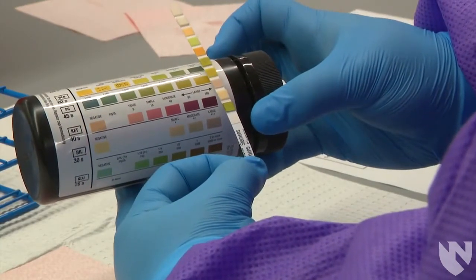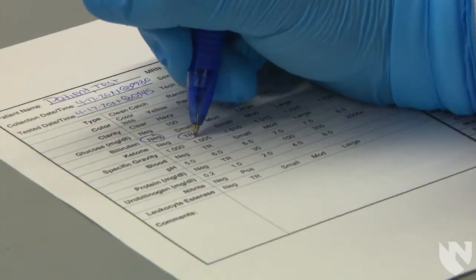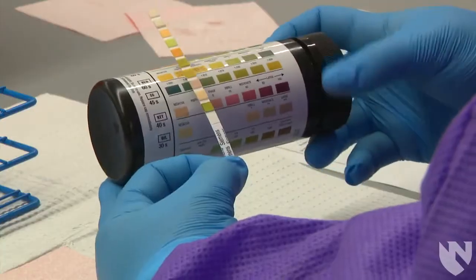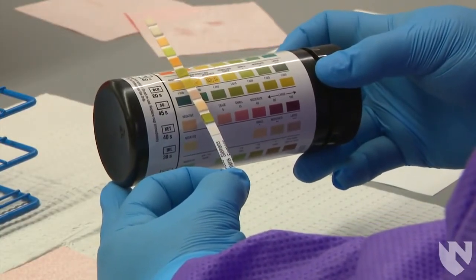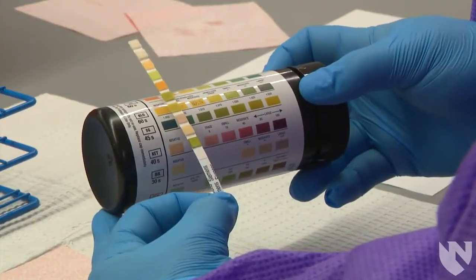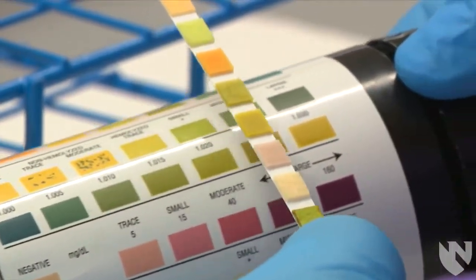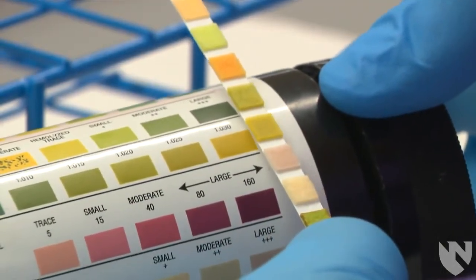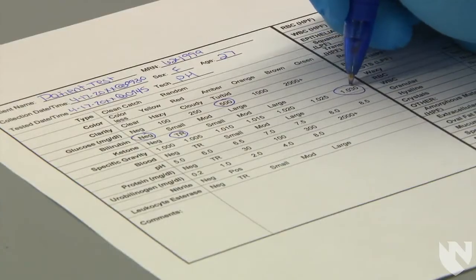Read the ketone reaction at 40 seconds. The amount here is trace, and record your answer on the worksheet. If the reaction color is in between two color squares on the canister, choose the lower concentration or value. Read the specific gravity reaction at 45 seconds, and specific gravity of this urine is 1.030, and record your answer.